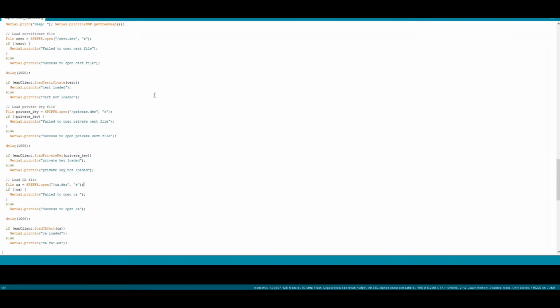Coming to the Arduino IDE, this is the code that is directly flashed onto the microcontroller. For an authenticated connection with the corresponding AWS account, we have generated and used certificates which have been appropriately converted to their formats, which can be read by the microcontroller using OpenSSL. For the MQTT broker to work with the Android application, we use the AWS Cognito service in place of this. This is the code, as you can see.